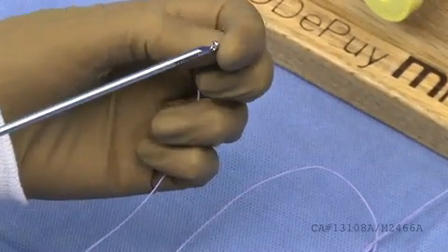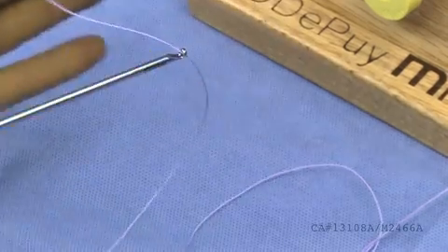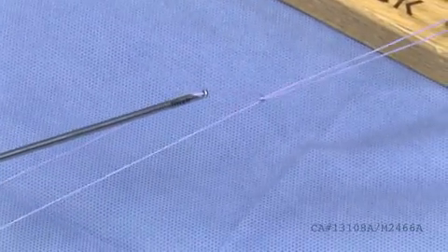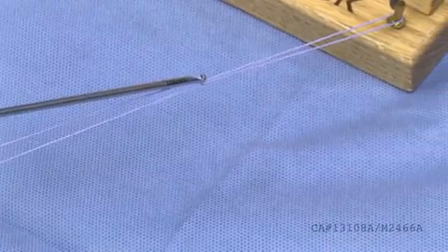To slide a knot down onto the tissue, thread the suture through the eyelet of the knot pusher. Slide the knot down to the desired location.